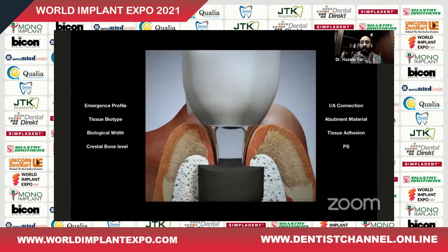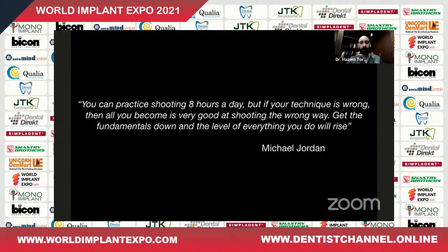We're going to also look at tissue adhesion, which is a very important topic because it relates to all that we're talking about. Tissue adhesion depends on the initial situation of the tissue, the healing protocol, and the healing sequences that we go through of socket healing and ridge healing, and the material of choice for our abutment and implant placement. And we're going to look at platform switching.